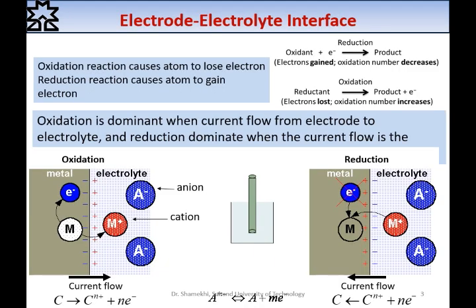Let me describe some basic chemical requirements about the electrode before talking about the details of a practical fabricated electrode.